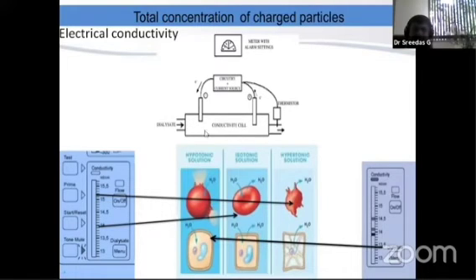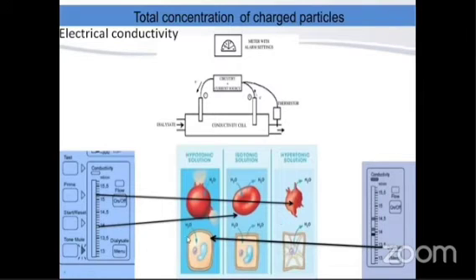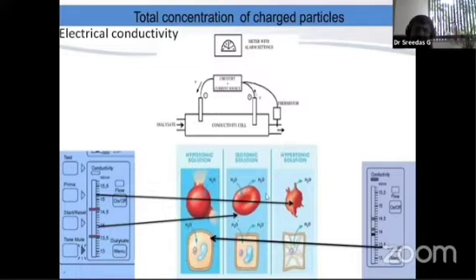The dialysate passes through the cell, and if the composition is different, the alarm rings. As you can see here, this is the normal range of conductivity. In the normal range the dialysate will be isotonic, and the RBC shown here will maintain its normal shape. But if the conductivity is high, that means the dialysate solution is hypertonic, that is, the blood is subjected to a hypertonic solution.